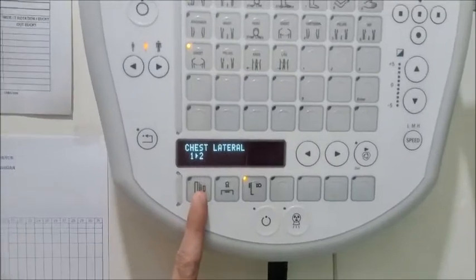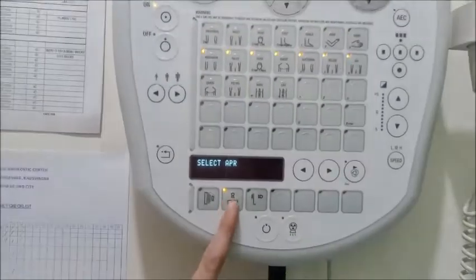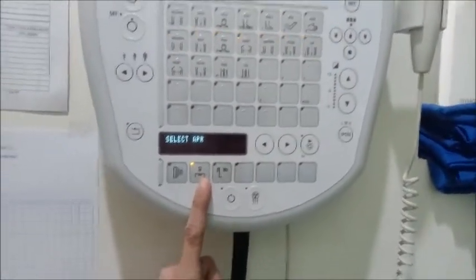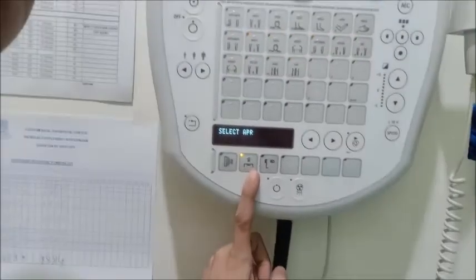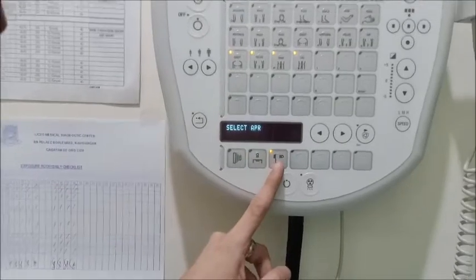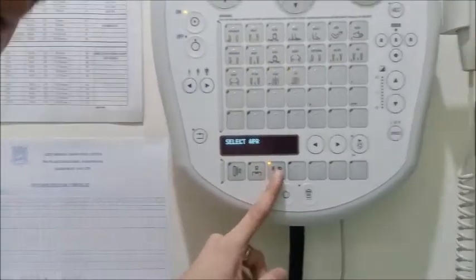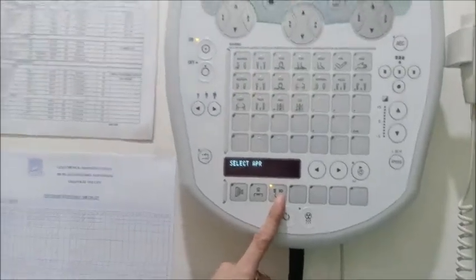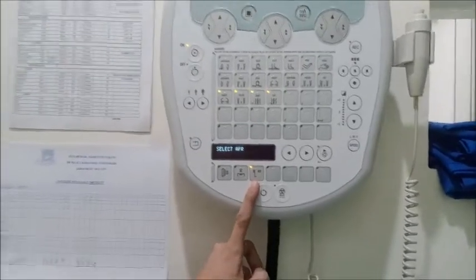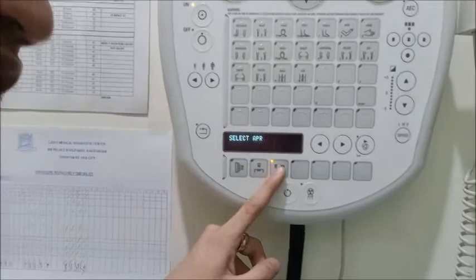Okay, so again, out baki. That means we will not use the grid. This is the table baki. So that means what moves during the exposure is the grid in the X-ray table. This is the indication that we will be using the chest baki. Okay, so that means during the exposure, it will be the chest baki that will move. So since we are dealing with a chest examination, we press this one. So the chest baki.